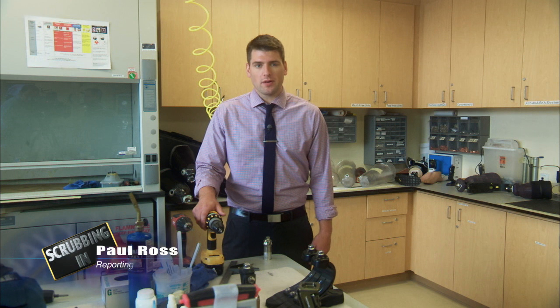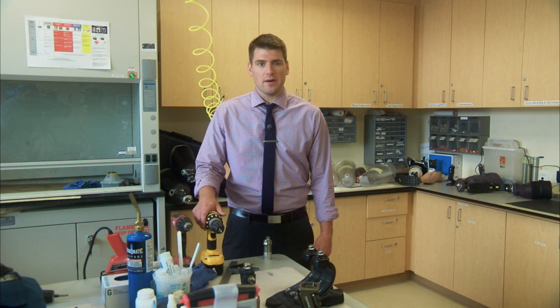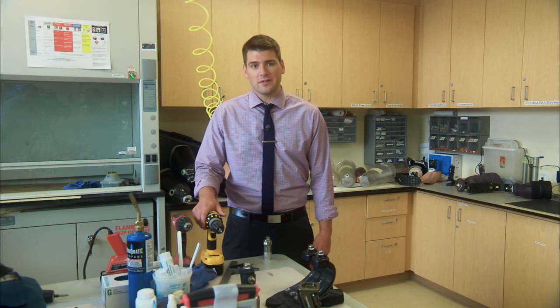Welcome to Scrubbing In. I'm Paul Ross. I'm going to take you around Navy Medicine to show who we are and what we do. We're at the Prosthetics Lab at Naval Medical Center, San Diego. And while this might look like a machine shop, it's actually a place of healing. Let's see how they do it.